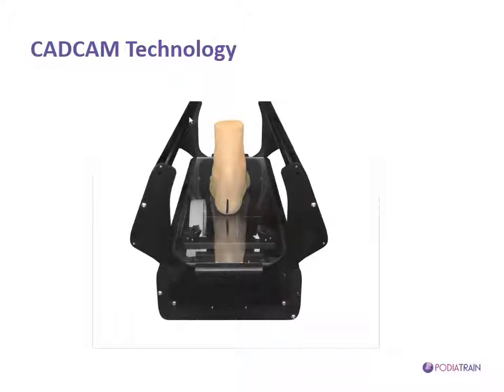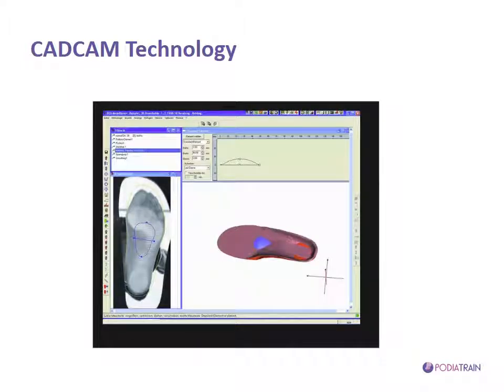Once we have scanned the foot, the next important component is the software. The software allows us to design, so as the name implies, CAD, computer aided design. It will allow us to design our device, our insole in this case, to our specifications.